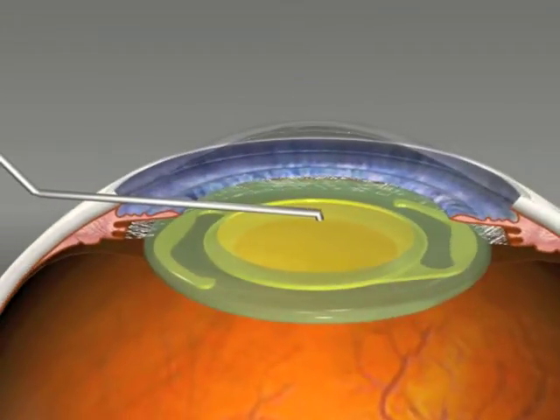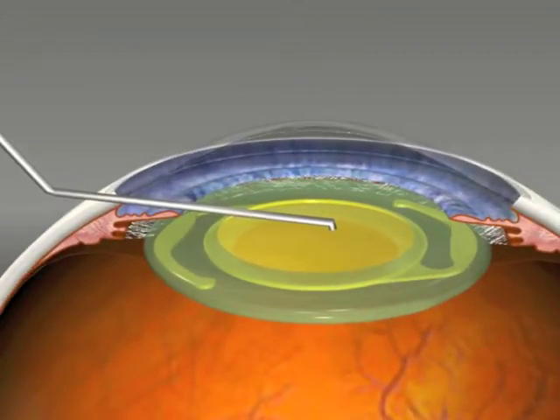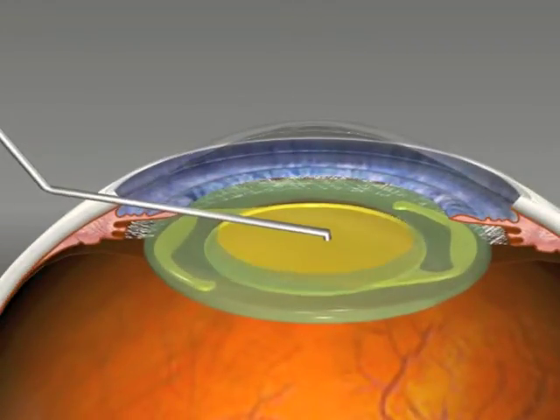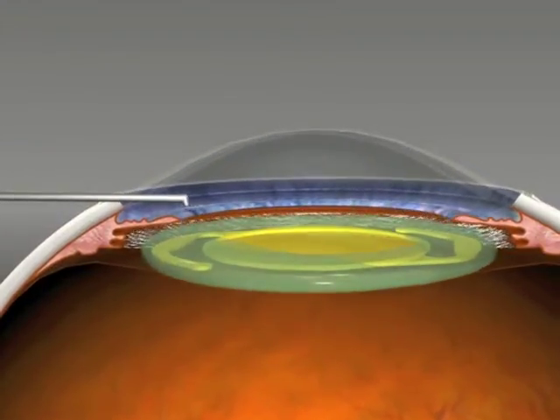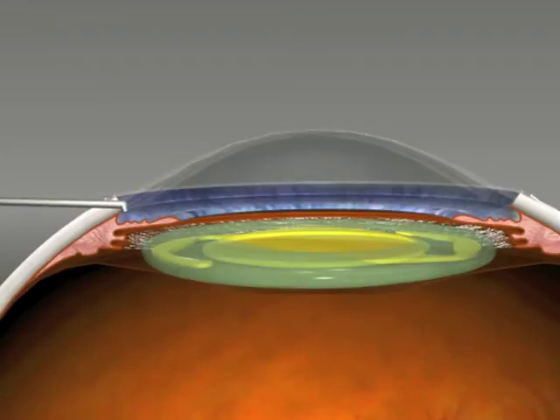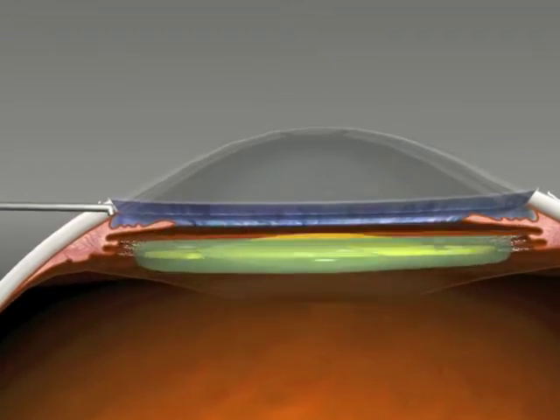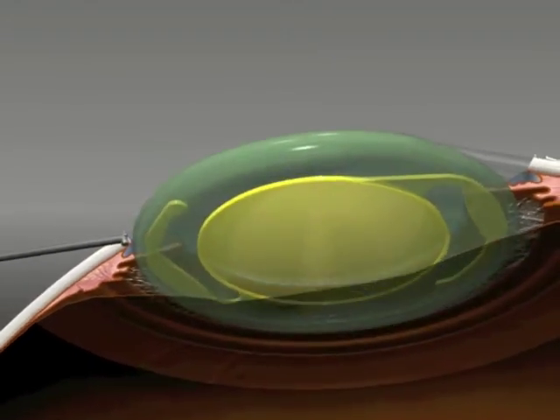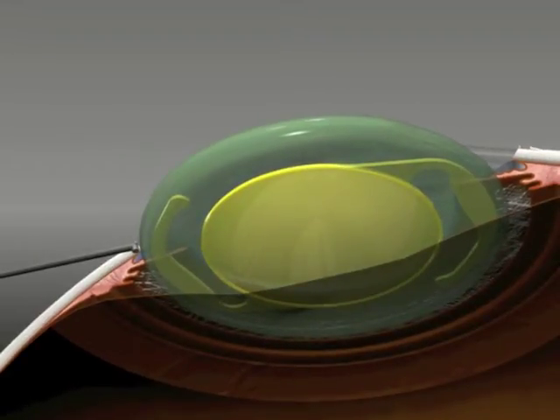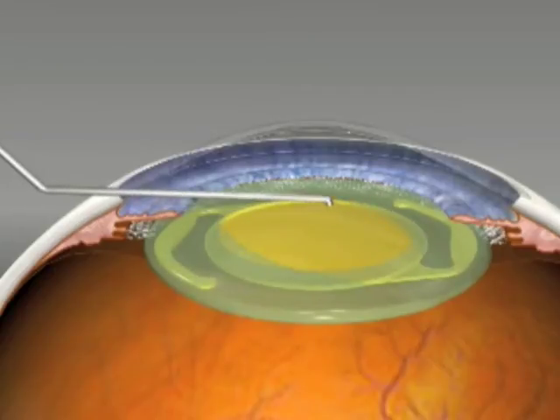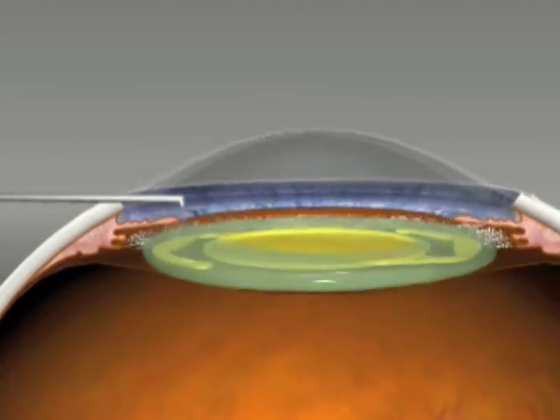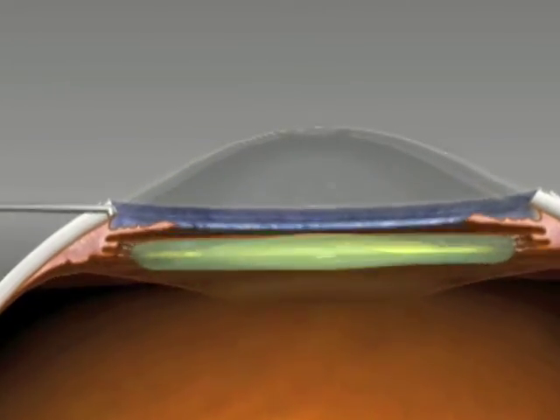In pediatric eyes we like to use posterior optic capture. I like the technique of sulcus placement of the haptics pushed through the anterior and posterior capsule rexus as published by Brian Dubroff, but a one-piece lens if that's all available can be put in the bag and then the optic pushed through the posterior capsule rexus.